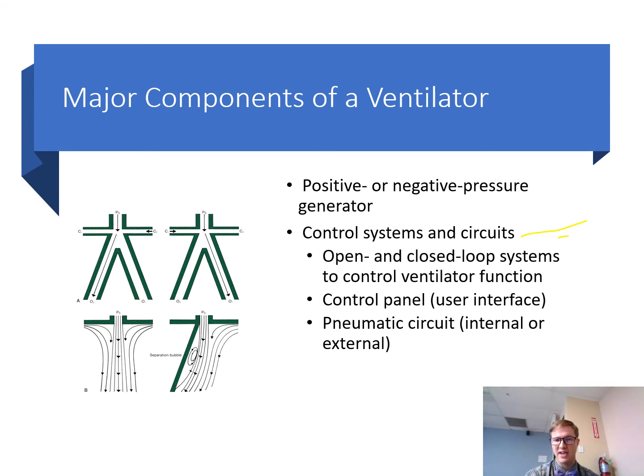When we're looking at fluidics, and that's why I have the picture here, down here, basic components of a fluidic or pneumatic mechanisms. When we see up here, this is an example A of a flip-flop valve or beam deflection when you're looking at this picture here. When a continuous pressure source in inlet A enters the wall, attachment occurs, the output is established, and the signal gas pulse from C1 deflects the beam to the outlet O1, right? So when we look at this, the wall attachment phenomenon is called the Coanda effect.